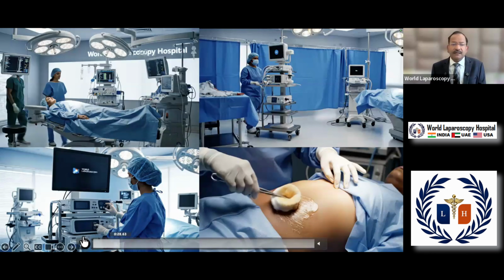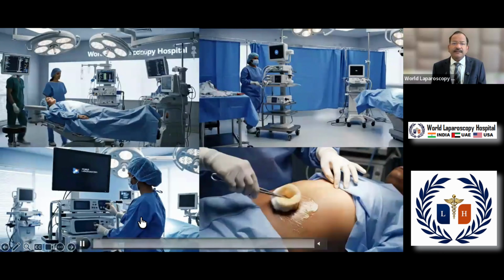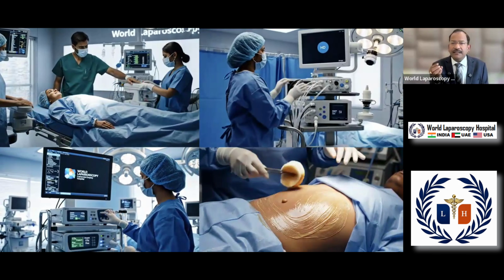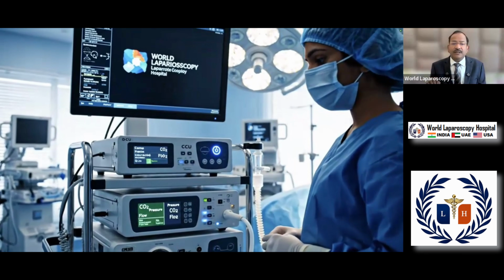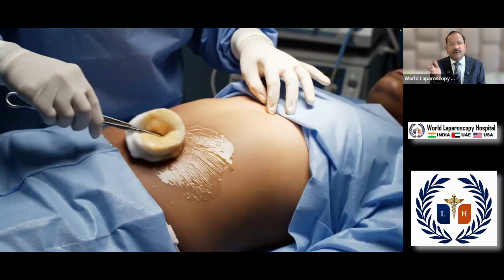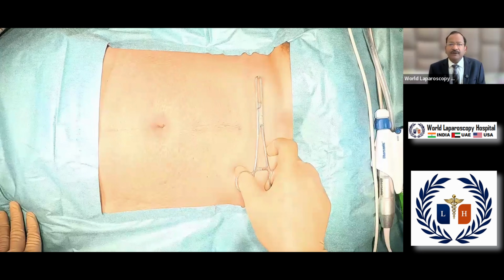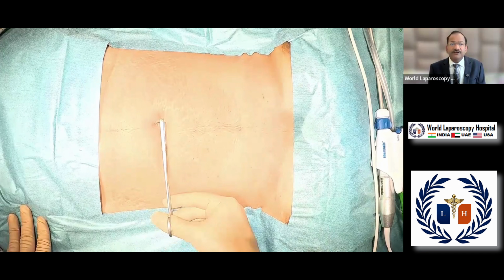So once you start, again I will show you, you apply 2 Ellis forceps on either side. Then you hold the Veress needle like a dart and give one small stab. Before doing that, all the towers should be turned on: insufflator, camera, and light source also, so that the insufflator will remove all the air. Then do proper painting all around with betadine and alcohol, both can be used. A scrub should be done. After that, you will apply 2 Ellis forceps on either side to invert the inferior crease of the umbilicus.